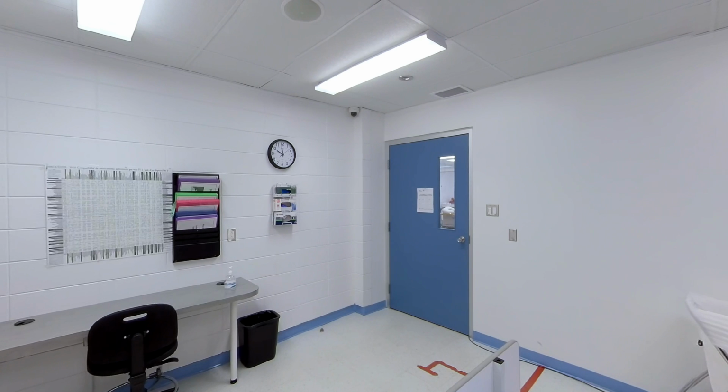Gown changes are performed as follows. A clean gown is placed nearby. The hospital gown is removed from the non-IV side and pulled over to the IV side.